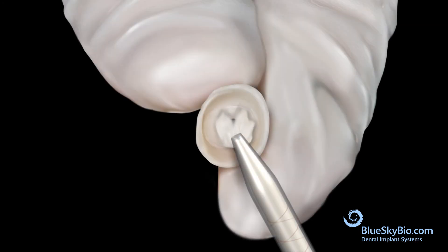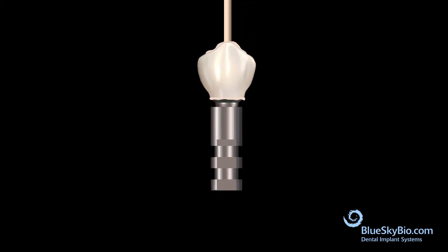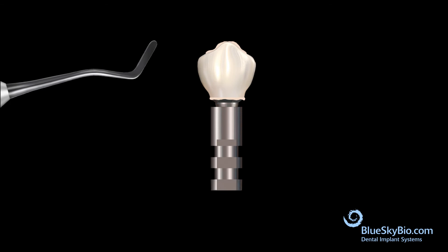Insert bonding material into the crown and bond the crown to the abutment. Remove the wood stick and remove any excess bonding material.